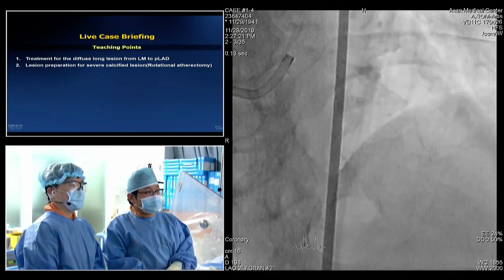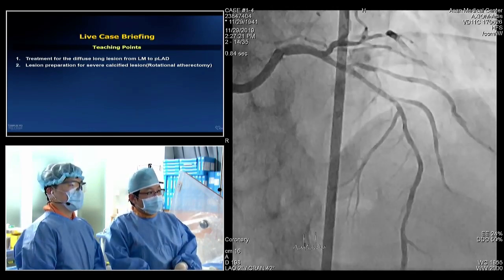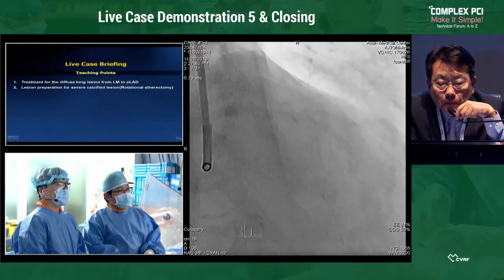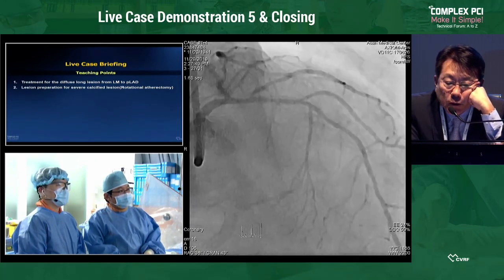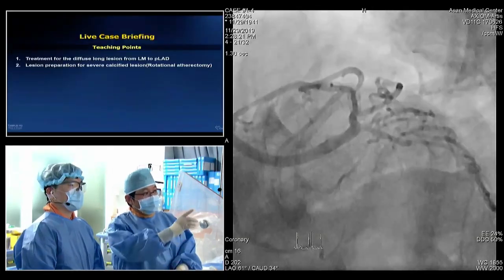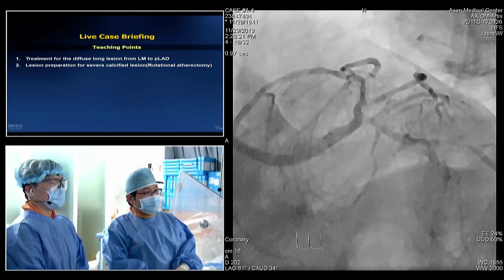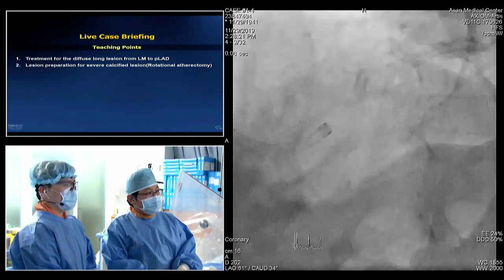Very diffusely calcified. You can see the calcium surrounding the vessel. There is heavy fluoroscopic calcification from the proximal LAD, left main, and to the mid portion of the LAD too, right? So this is very interesting. This is not a stent, but the calcification. Because of long-standing diabetes and older age, we can explain the very severe vascular calcification.